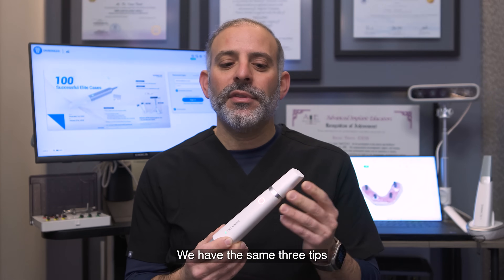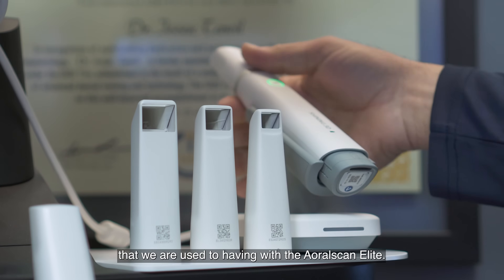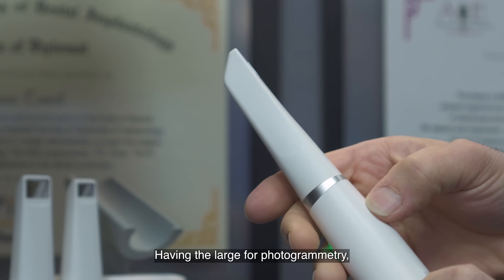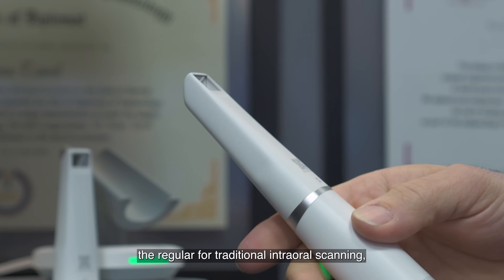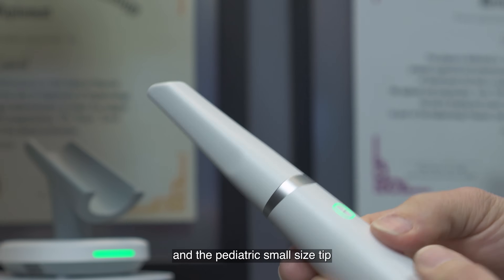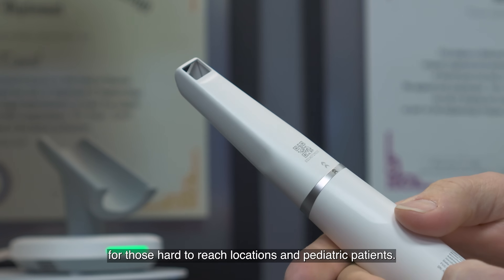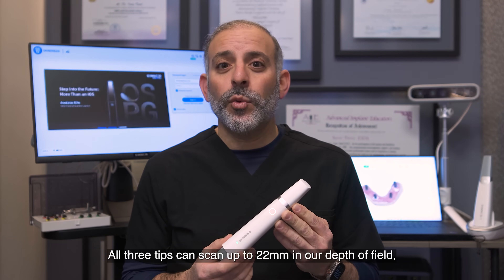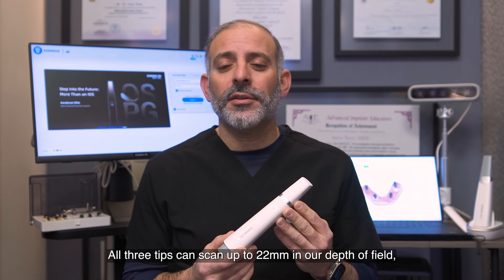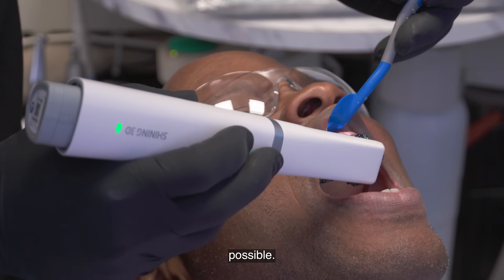We have the same three tips that we are used to having with the Aoral Scan Elite: the large tip for photogrammetry, the regular for traditional intraoral scanning, and the pediatric small size tip for those hard-to-reach locations and pediatric patients. All three tips can scan up to 22 millimeters in depth of field, making capturing the deepest restorations possible.